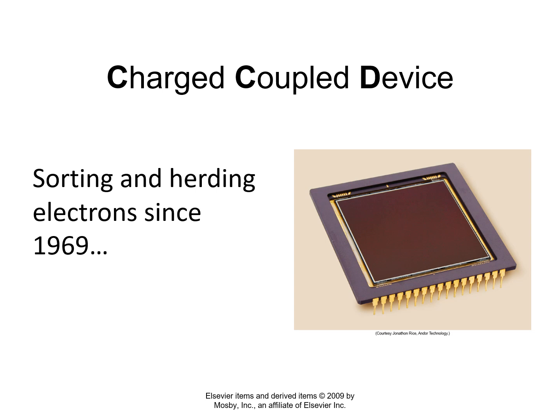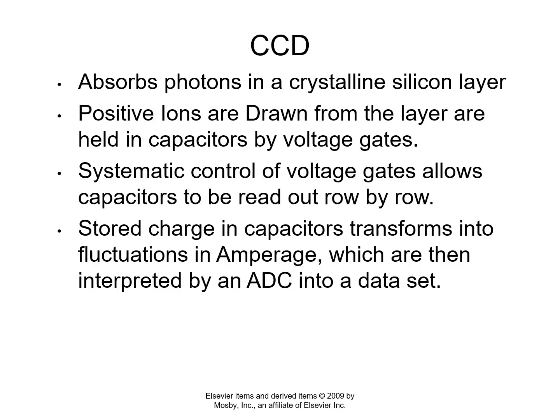That is, we could divide a solar panel into a grid with very, very tiny grid elements, and each grid element would catch its own photons. And so we could tell the difference between bright areas and dark areas on the solar panel. That's essentially what a CCD is doing, okay? So with the CCD, the photons come in and hit this silicon layer. What that's going to do is create a separation of orbital electrons. It's almost like ionization. There's a separation of valence shell electrons from the silicon atoms. Okay, that's the photovoltaic effect.